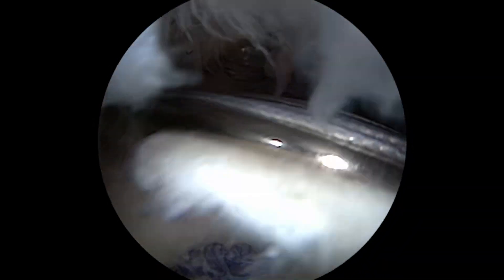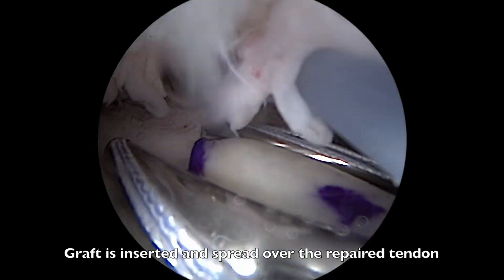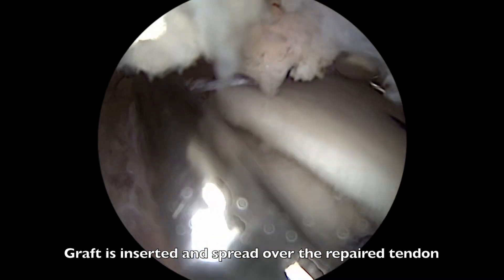The rotator cuff repair has already been completed. The graft has been inserted and spread over the rotator cuff repair, and is now positioned accordingly to cover the repair.